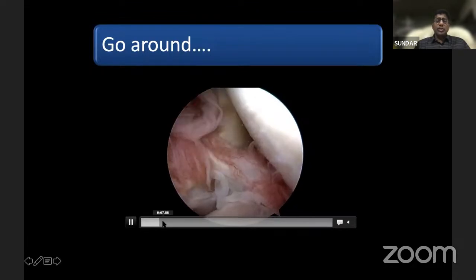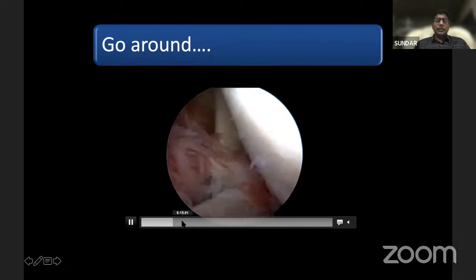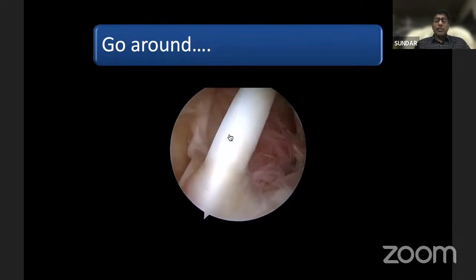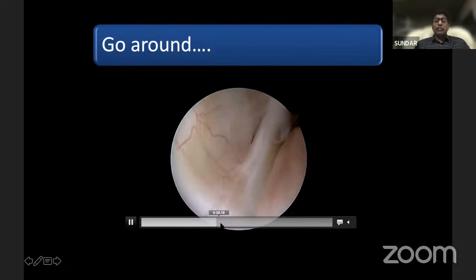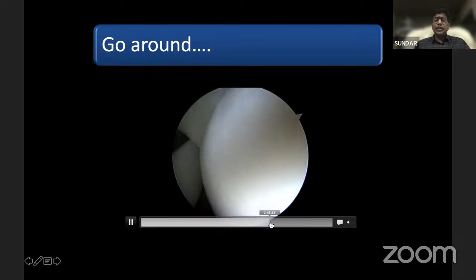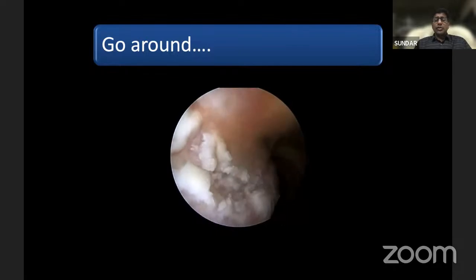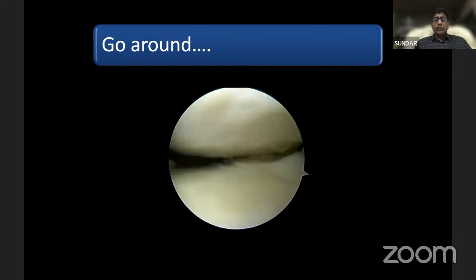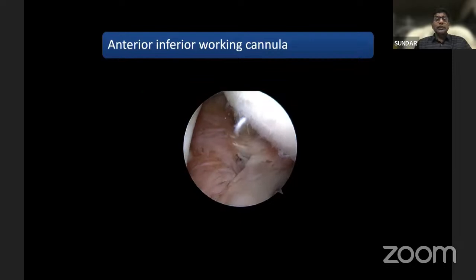Of course, as soon as you enter, you should do the diagnostic arthroscopy. As soon as you enter, you see the rotator cuff interval, then you see the subscapularis over there. Then you see the biceps, which can be assessed for any SLAP repair. Then you assess the biceps groove. Then you assess the cuff, because in older patients you can have cuff lesions. Then you can go behind and assess the Hill-Sachs lesion. So this is how you assess your bony part, that is the axillary fold. You come to the anteroinferior aspect, then you assess your glenoid labral tear. You can see that is a huge labral tear.